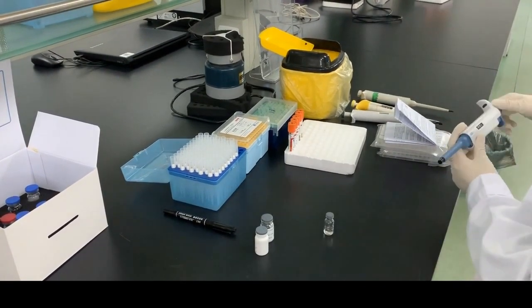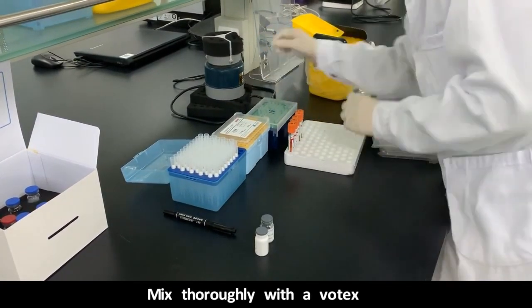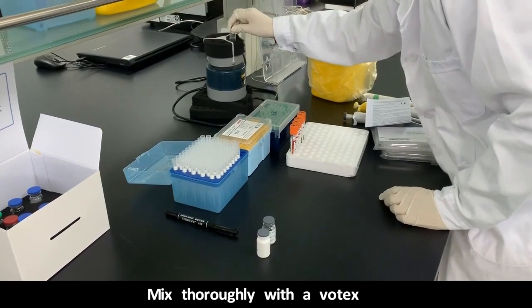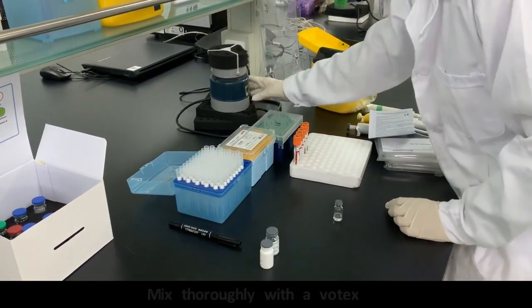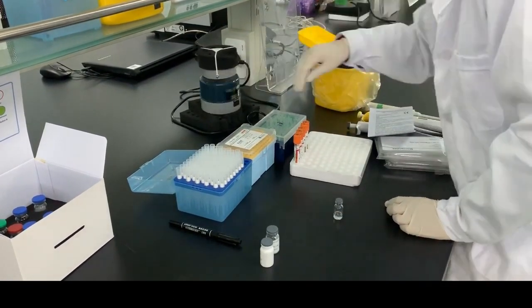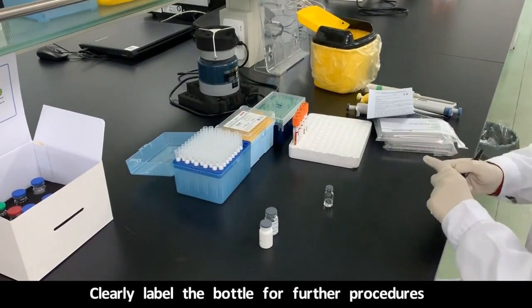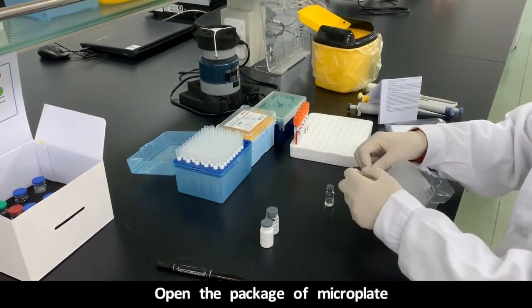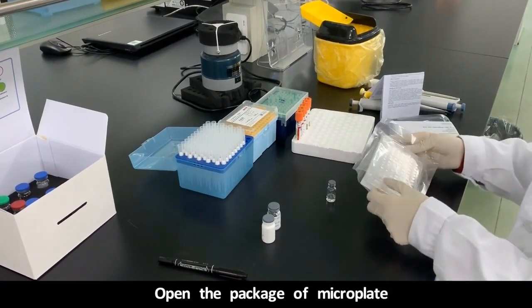Close the lid, and then this mixed preparation of A and B needs to be vortexed thoroughly to ensure that it's fully mixed. And label the solution so you know which one this is, because this vial looks similar to the standard curve bottles. Then open the plate, removing it from its plastic wrapping.